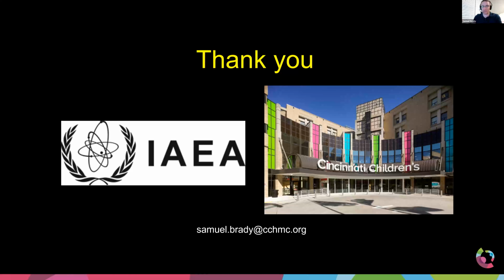You as a hospital may choose lower. I would just recommend you look at your data. And if you're not collecting this data, start doing it now. You'll start to see, just as you log it, how many patients will surpass a certain level. I know in Thailand right now, they're starting to distribute the radiation dose monitoring software. That's great because the dose monitoring software will help you do this, because then you can just run reports really quick and easy.